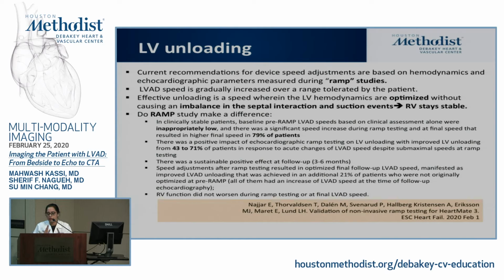So for instance, if you do one at the time of discharge, they may need another one in 6 months or so. And why could that be? One, of course, their RV overall changes. Once they've been on LVAD support for a long time, they may have worsening RV function, or they may have improvement in RV function. So there's a difference in how patients behave. So we may need to do these RAMP studies at maybe a 3-month interval or 6-month interval or somewhere down the line.